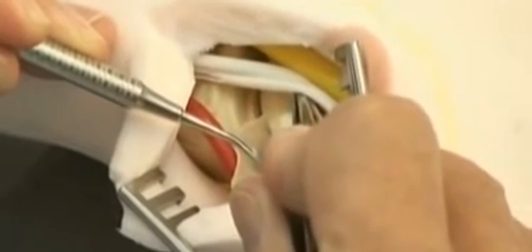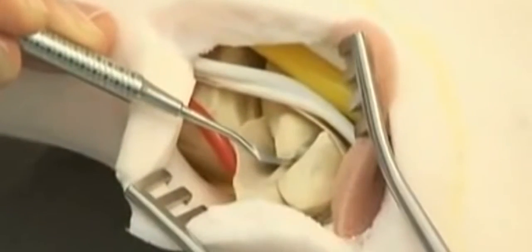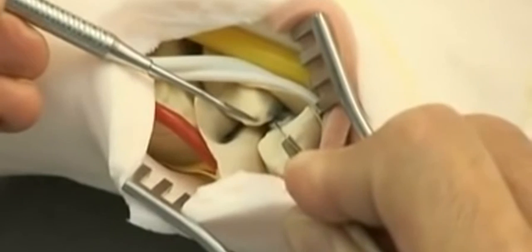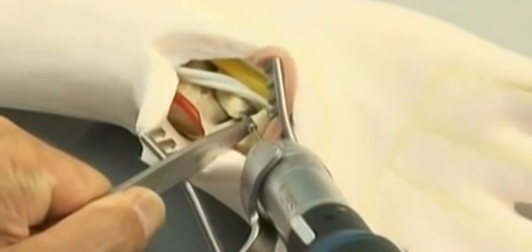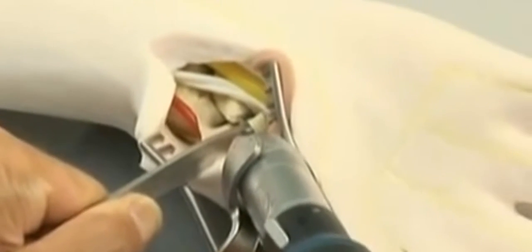To gain access to the correct entry point, a small portion of the overlying trapezium may have to be removed with either a small osteotome or a cannulated reamer. As an alternative, correct entry can be gained by opening the scaphotrapezial joint capsule and levering the trapezium dorsally to reveal the distal pole of the scaphoid. The guide wire is inserted using the 1.1 millimeter double drill guide. The tip of the guide wire should remain just within the proximal pole of the scaphoid. The depth is measured.